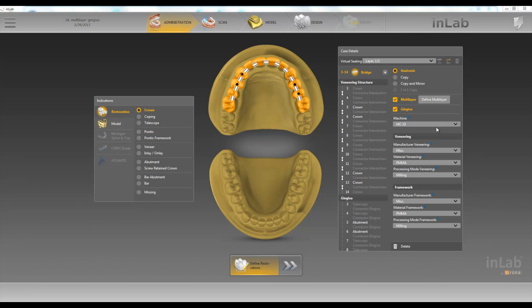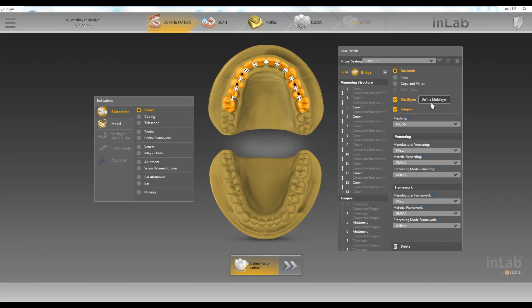So here we have a screw retain bridge. Let's say we want the bottom to be one material and the top to be another. So you just choose multi-layer and gingiva. You let it know what you want your veneering structure to be on the top and what you want your framework to be out of.